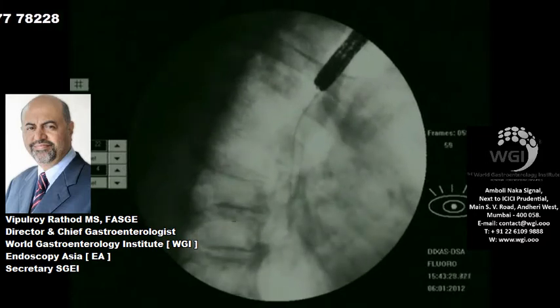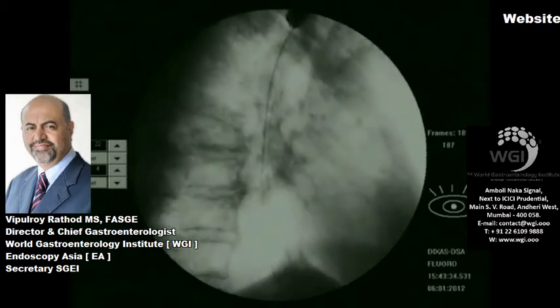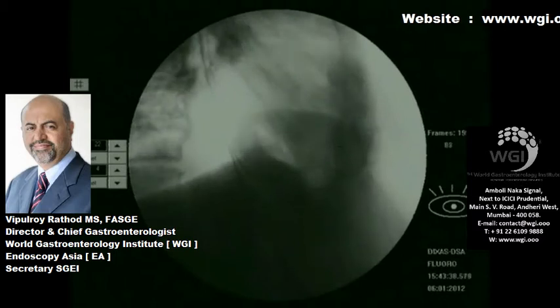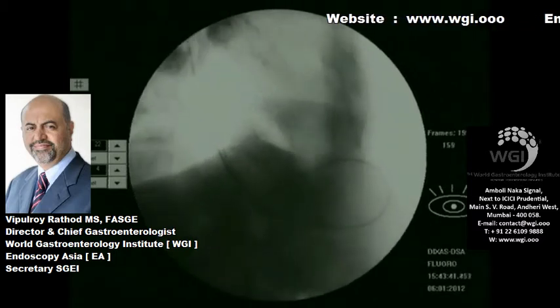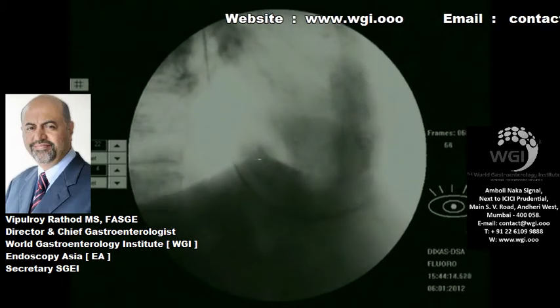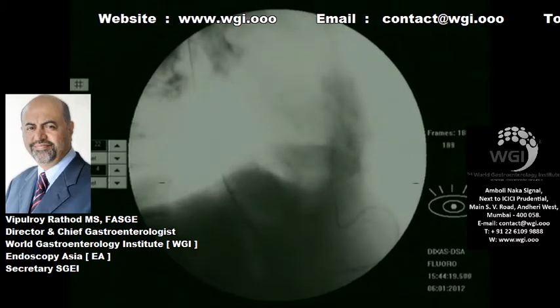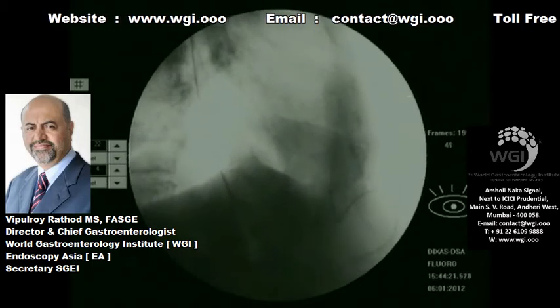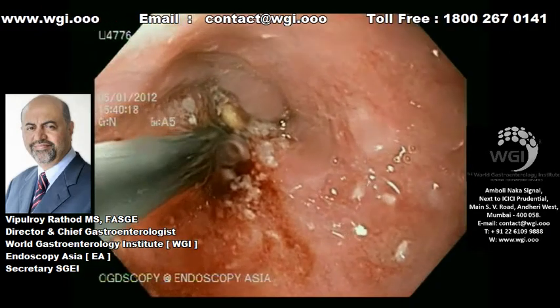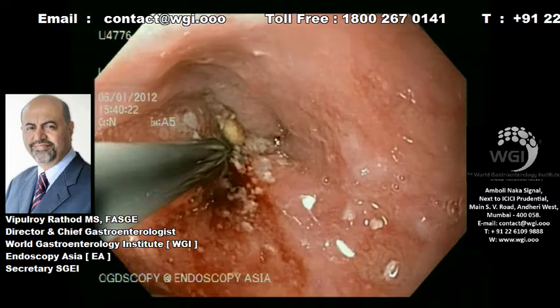You can see on fluoroscopy that we actually loop the wire and then gently push the wire. You can see the loop there, and the loop is going across the stricture into the fundus of the stomach. You can actually trace this on fluoroscopy. When you have an absolutely tight stricture such as this, you use fluoroscopy and then change to a stiffer wire once you pass the catheter across the stricture, as in this case — we have changed over to a stiffer wire.